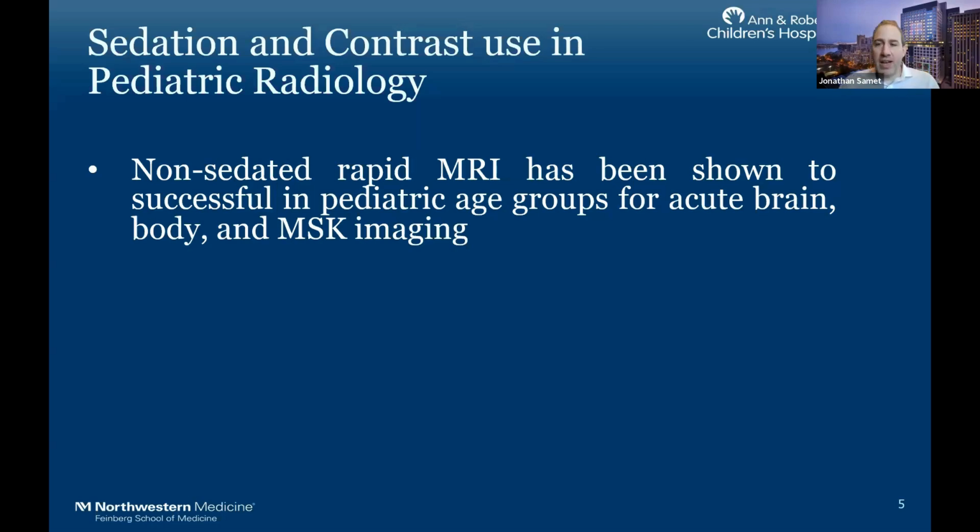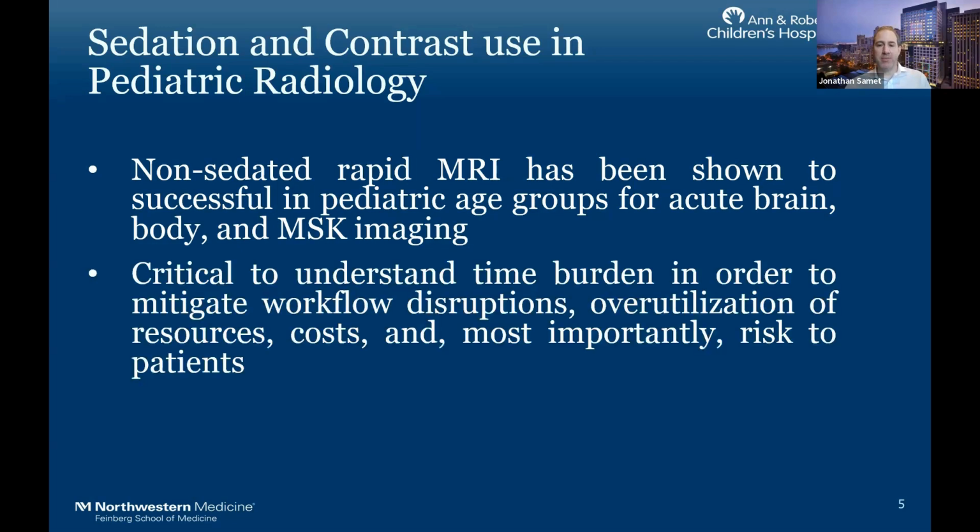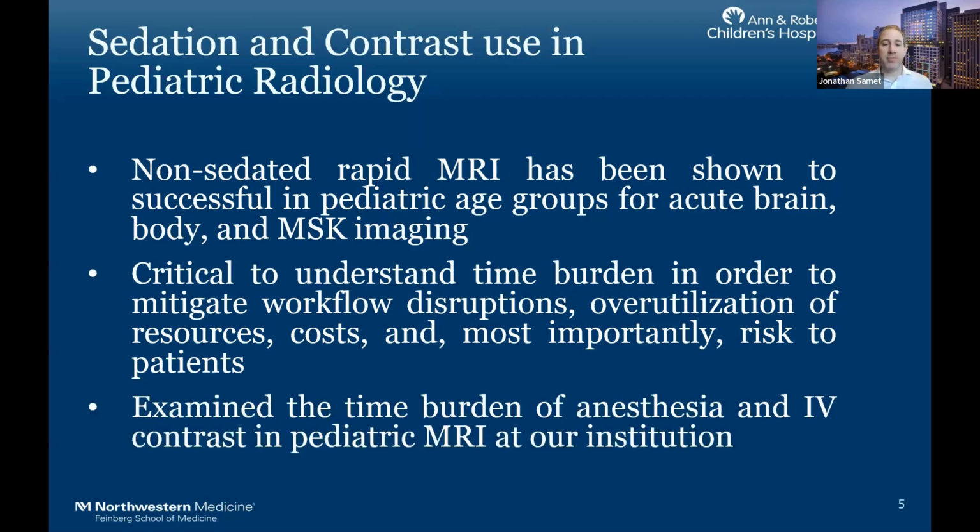We know non-sedated rapid MRI has been shown to be successful for acute brain imaging and for body imaging. We talked about MR appendicitis, and it applies to MSK imaging too. We need to really understand what the true time burden is in order to mitigate workflow disruptions, overutilization of resources, costs, and most importantly, the risk to patients.